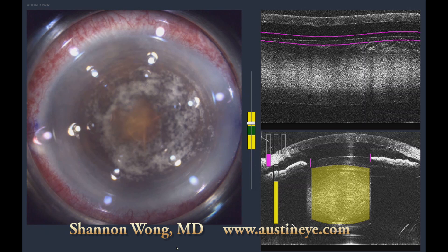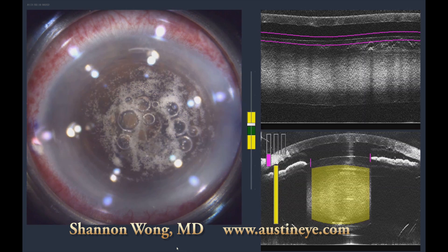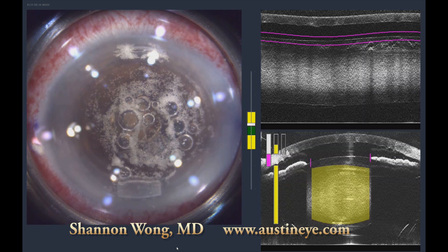This is using version 2.16 software of the LensX laser. For the sake of time, the phacoemulsification procedure was not shown in this video. This is just to demonstrate the fact that we can use the LensX in a very brunescent root beer type cataract without difficulty. Thank you for your time and attention.